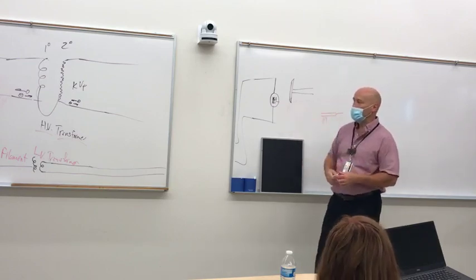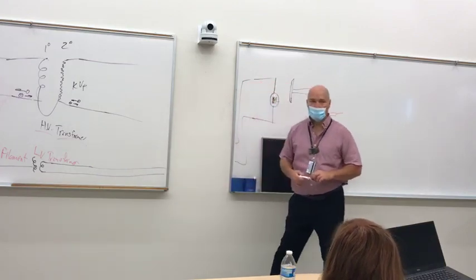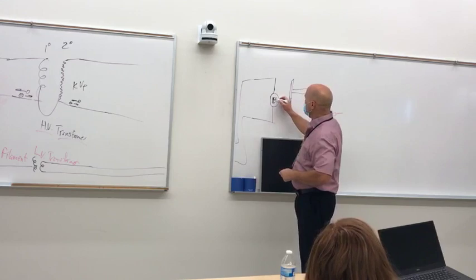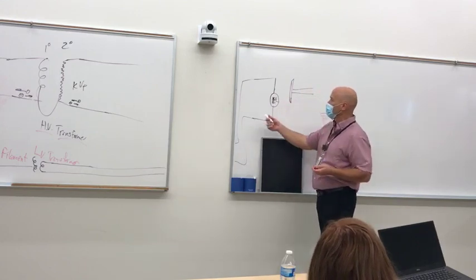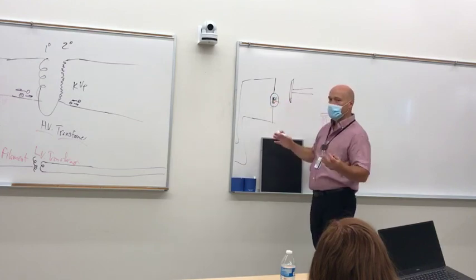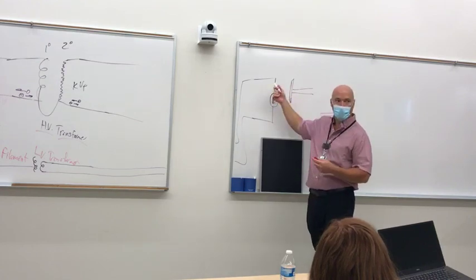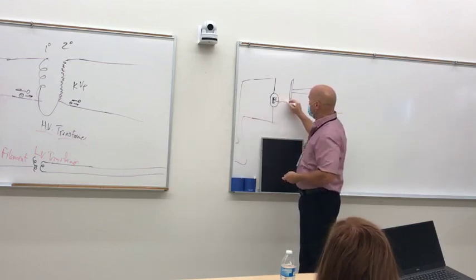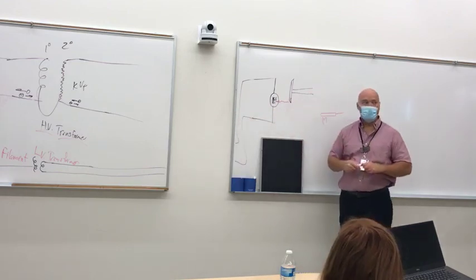You push the exposure, now you light up the high voltage section. So you send the high voltage over, and now you've increased the potential difference between here and here. You've got a collection of electrons that just can't go anywhere except through the filament. But whenever you hit it with a high voltage, what you're going to get is a miniature lightning bolt.